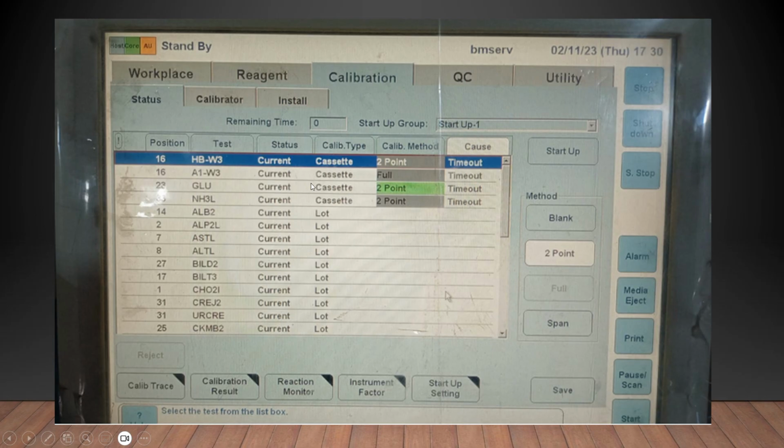Now, the important thing is that this is the Cobas C311 instrument, with CFAS calibrator. Multi calibrators may be present, or a single parameter, single calibrator may be present. So exactly which calibrator to use for which reagent becomes a little tricky. You don't have to memorize which calibrator is for what. You just have to go to Install.